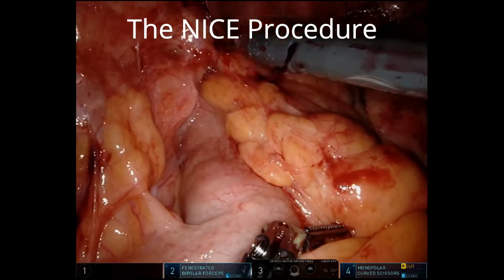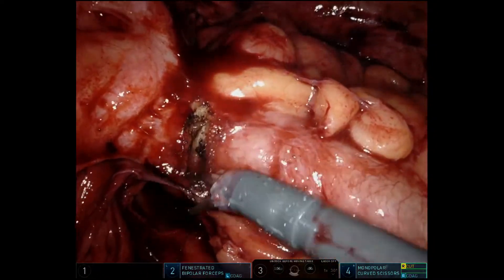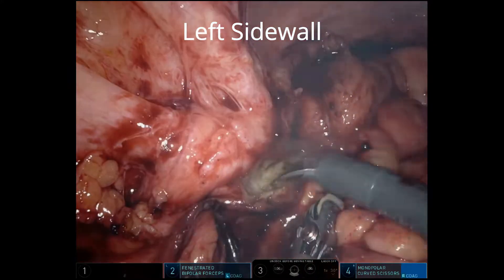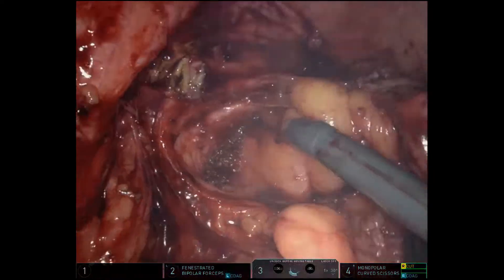This is the NICE procedure for severe diverticulitis — natural orifice intracorporeal anastomosis with extraction. In this procedure, we're going to see a technique that we're using more and more for patients in which we have suspected or proven COVID that require surgery. We want to minimize the potential of aerosolization of the pneumoperitoneum during the extraction process.